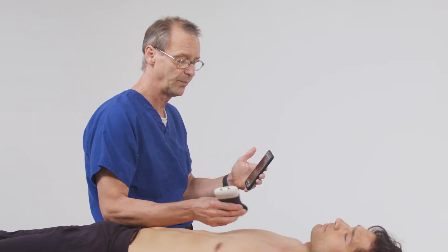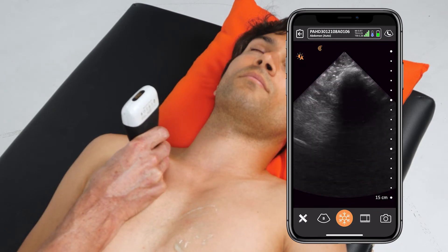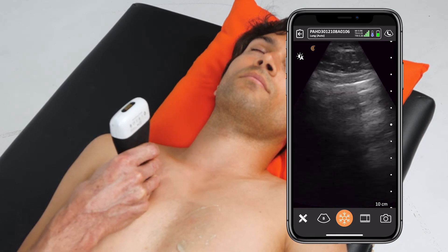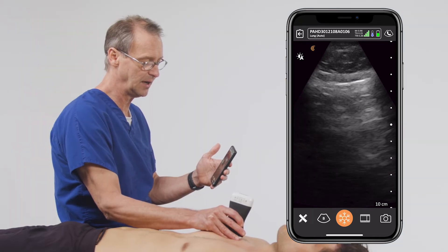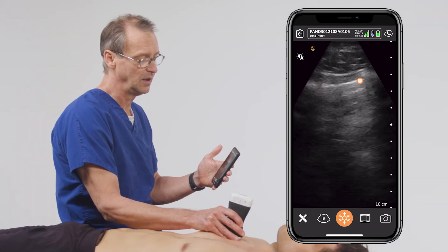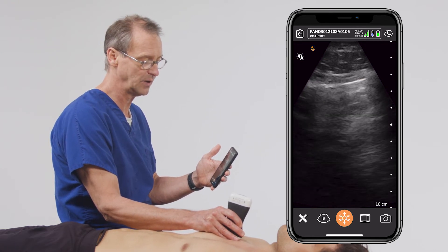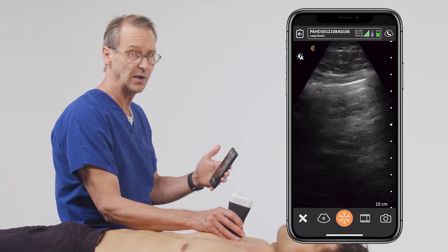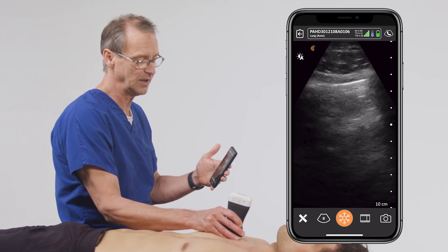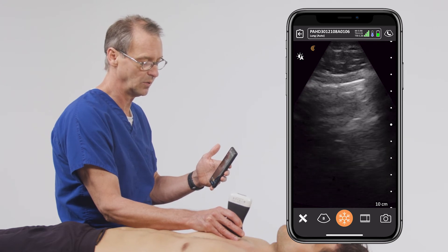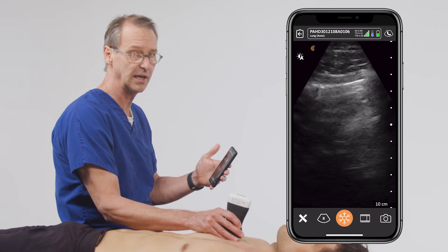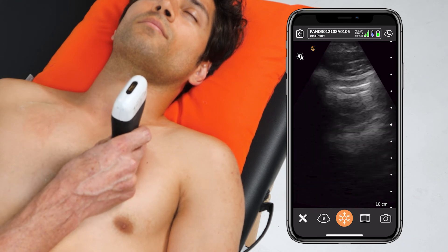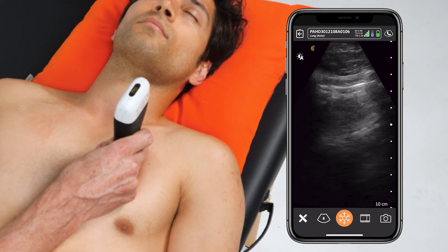The final part of the examination is to look at the lung. We're going to place our transducer at the mid-clavicular line between the first and second or second and third rib space, and we're going to see if we can pick up evidence of pleural sliding. This tells us the patient does not have a pneumothorax at that particular area. In addition, we're going to look for evidence of pulmonary edema by looking for the presence of B-lines. In this examination, we can obviously see pleural sliding, which is a normal finding, and we don't see any evidence of B-lines indicating pulmonary edema. We're going to do this examination on both the right and left sides of the chest, and once again we see pleural sliding and no evidence of pulmonary edema.